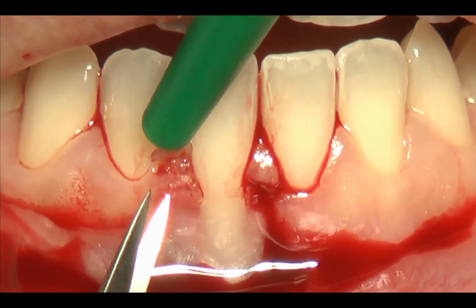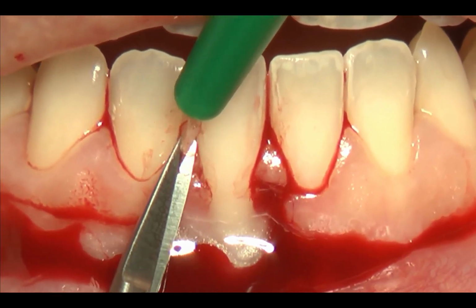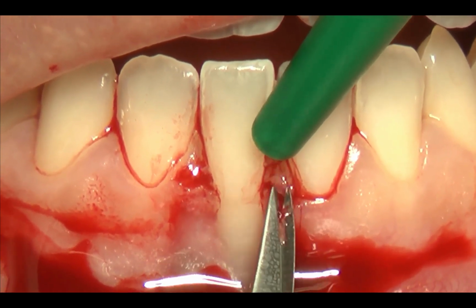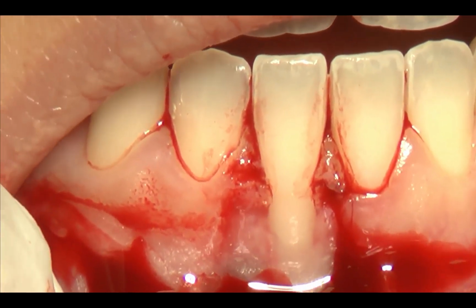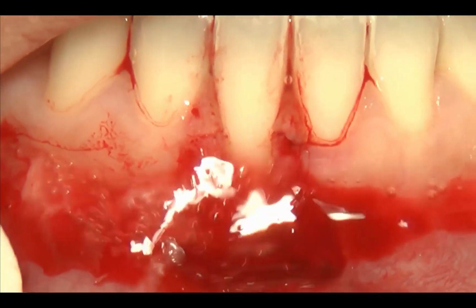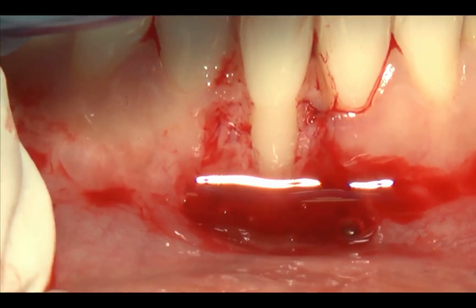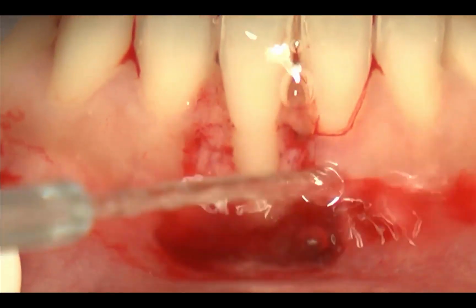You see that you need very long in order to reach the tip of the papilla as much as possible in one shot. Now the whole papilla is well prepared. We can remove the EDTA gel from the wound area.